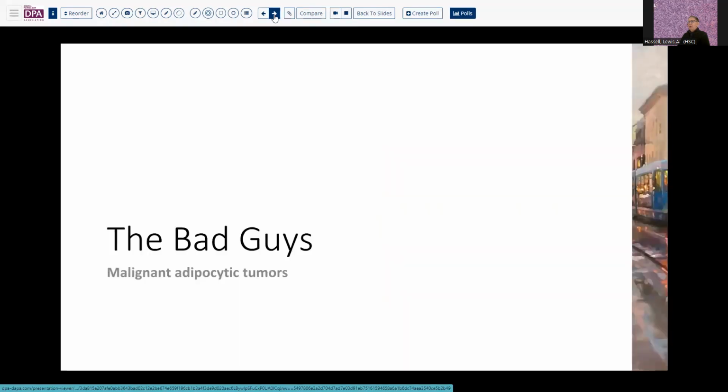So where does that get us? Well, that gets us to the bad guys. So let's pause for a second. If you have questions, put those in the chat or send me a quick buzz with that, and we'll try to answer them as we go forward into the malignant lesions.